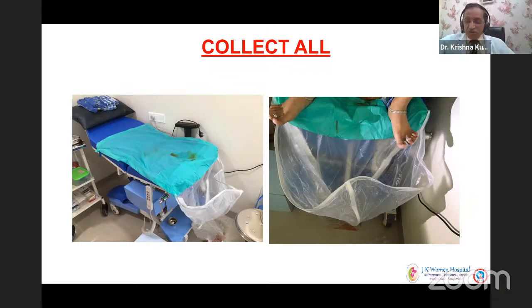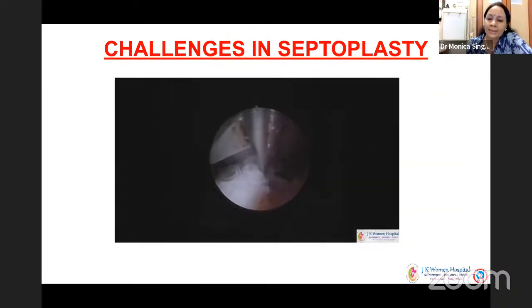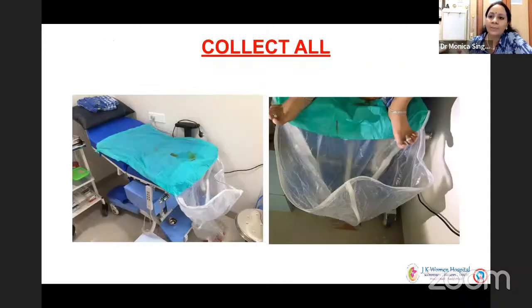Nitin gave a few tips, and those tips are important for delegates. Dr. Jyoti, you said that you're always in a rush and practically don't measure the fluid. What I do is, when I'm in the OT, I postpone my OPD in such a way that I don't have the pressure. We do the fluid measurement very accurately.